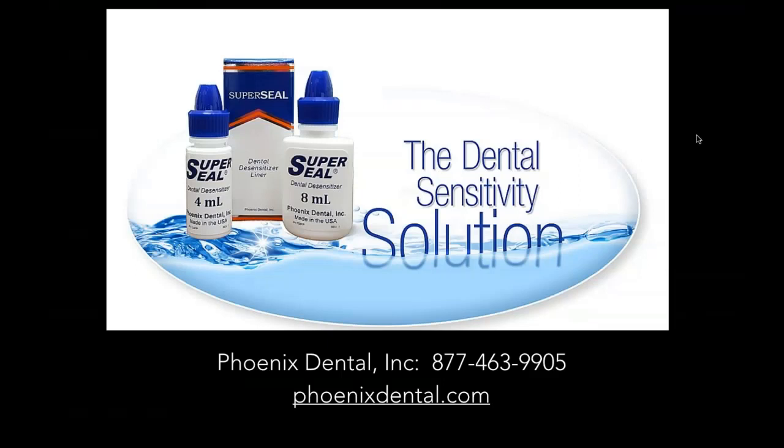One of the things I also do when I'm done prepping is I use a product called Super Seal. It's made by Phoenix Dental. It was founded by Charlie Cox, and many of you may know Charlie Cox is a pulp biologist. The company doesn't even know I push this material, but I know the family very well. It is a desensitizer, but it also takes off the smear layer.